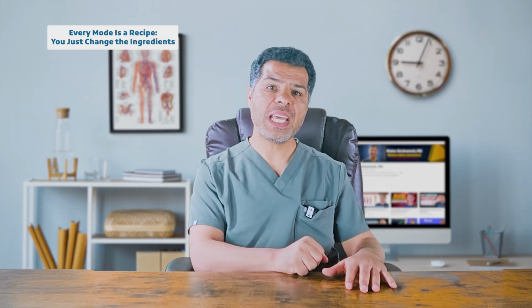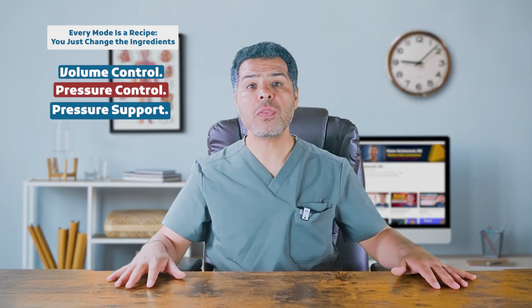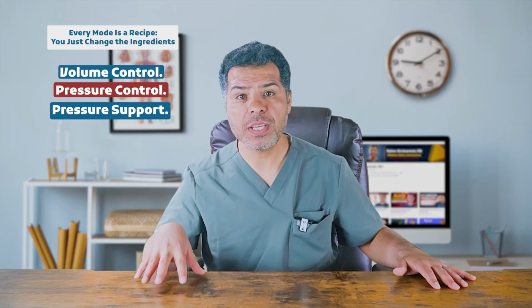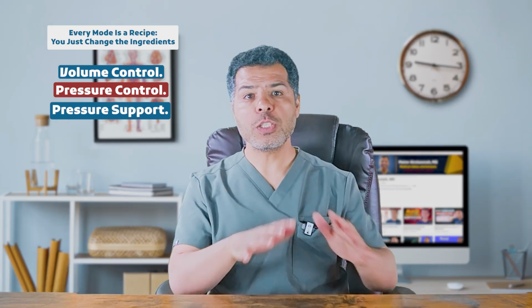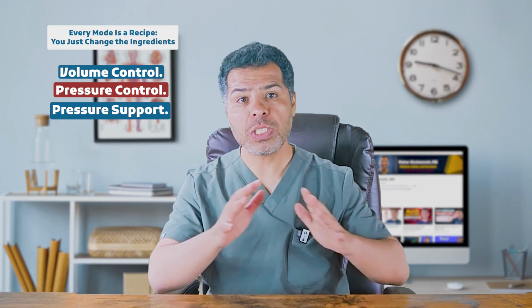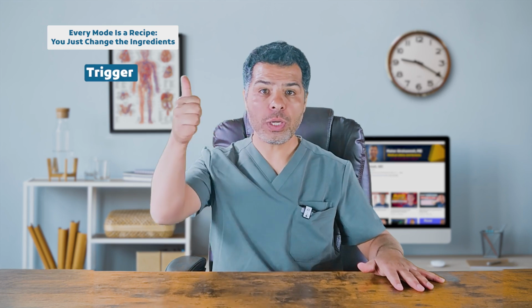At the heart of mechanical ventilation, there are three fundamental modes: volume control, pressure control, and pressure support. Every other mode you will encounter is either a hybrid or a modification of these three basic modes. And to make sense of any mode, we just break it down into the three key ingredients we just explained: the trigger, what starts the breath; target, how to deliver the breath; and cycle, what ends the breath.